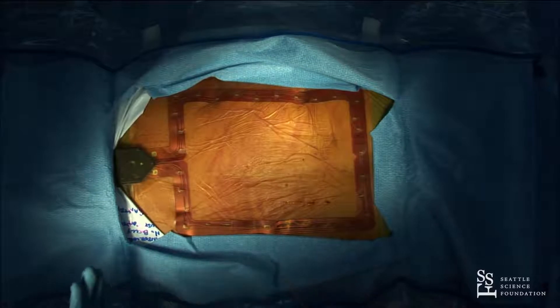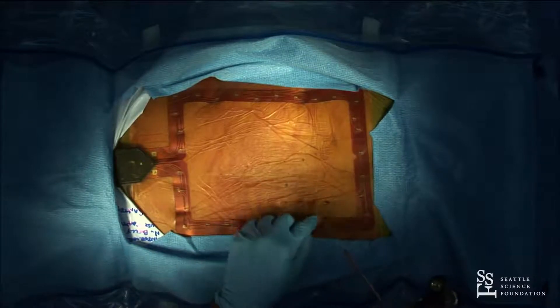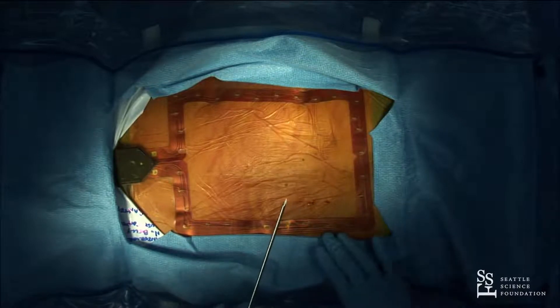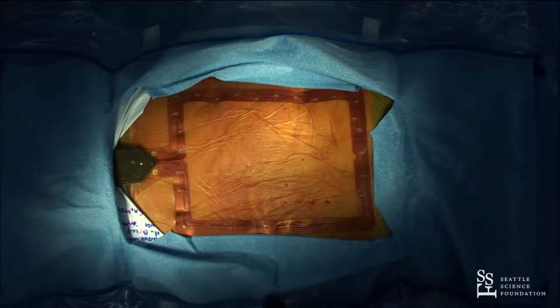I've also dealt with the skin shift problem. When I'm putting in Jamshidis, putting in a tube, angling the tube, or dealing with bleeding around the tube entry, any of those things can cause skin displacement. So in that scenario I place the tracker well above the area where I'm working.